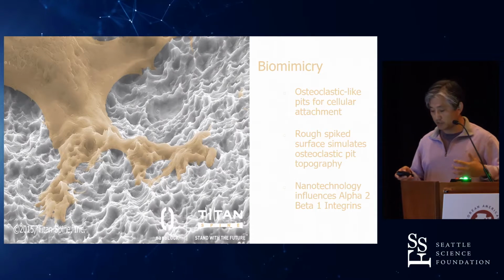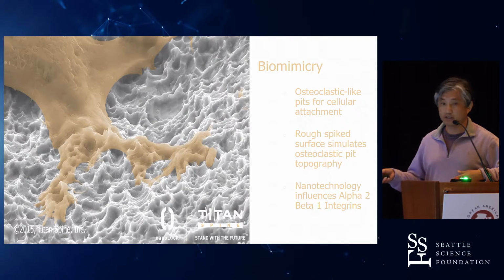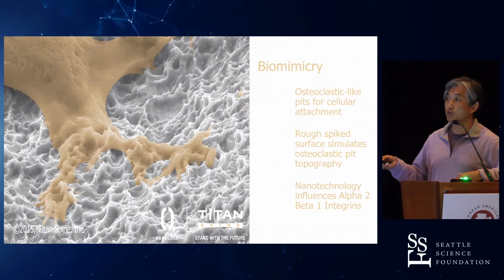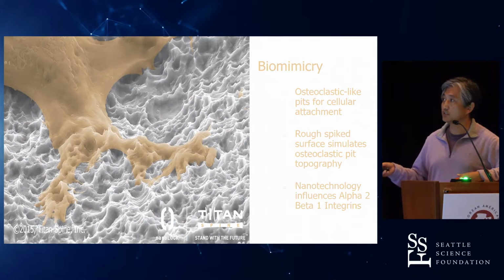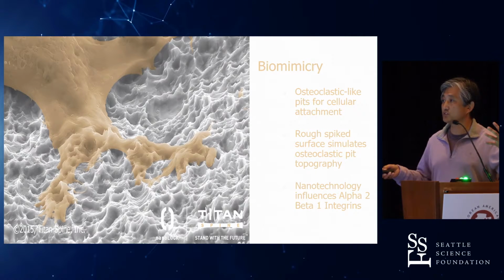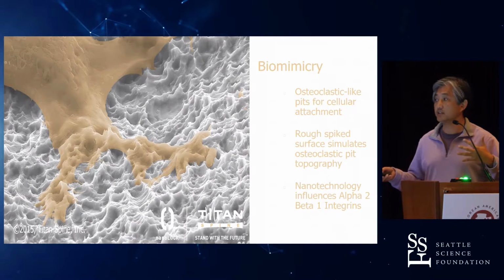So biomimicry, and this is again a very nice electron microscopic image provided to me by Titan Spine, shows that when you put in a progenitor cell, it does find a way. It just travels across it and attaches to these osteoclastic-like pits for cellular attachment. The surface simulates the same pits that you would see in the bone itself, right?